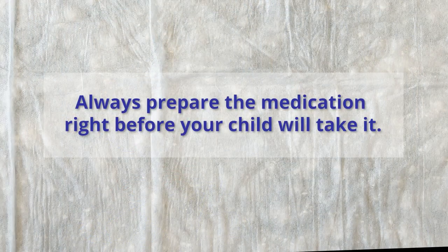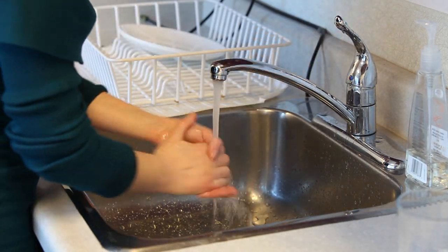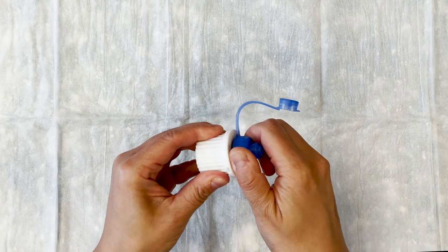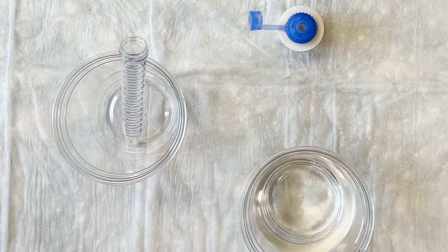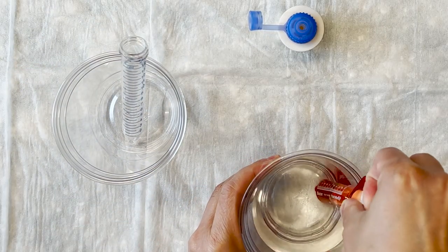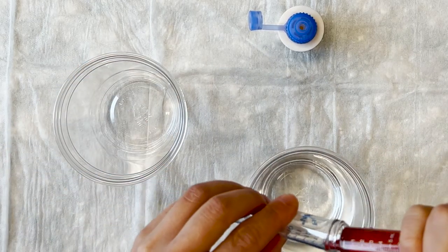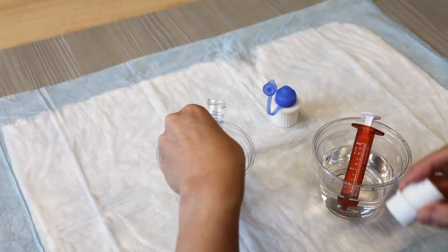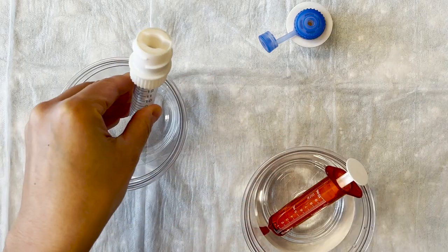Always prepare the medication right before your child will take it. Before you begin, wash your hands with soap and water. Connect the blue screw top from the dissolve and dose device to the capsule shredder adapter cap. Fill the dissolve and dose tube with the amount of water specified by your healthcare provider.